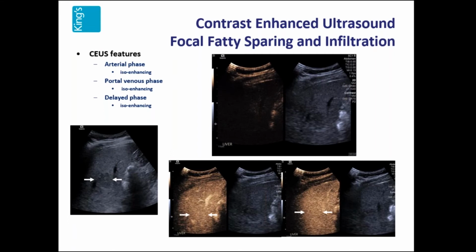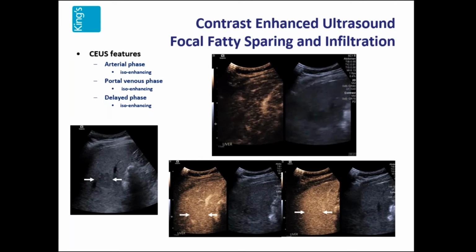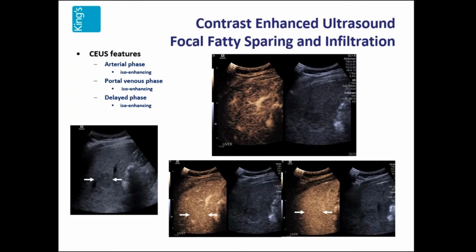Another interesting area, and we see much more of this now, particularly in the pediatric patients, is focal fatty sparing and infiltration. And of course, it's nice to be able to do an ultrasound contrast examination in a patient with this sort of focal lesion to alleviate the anxiety not only of the parents, but the referring physician. And it should behave exactly like the rest of the liver.